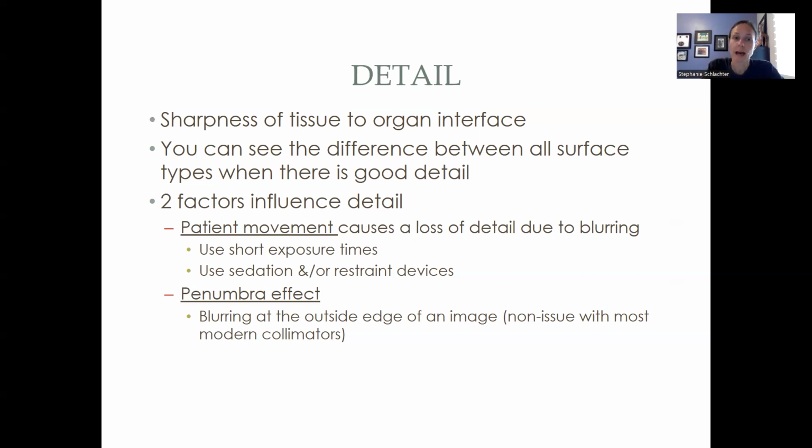So to avoid that, we want to either take shorter exposure times, right? So less time, so there's less opportunity to see that movement, or we actually use sedation and or restraint devices for our patient. If they're sedated, they shouldn't be panting, hopefully. They shouldn't be shaking and all that. They should be nice and relaxed. So you should be able to get a nice, still patient so that you don't have any movement, okay?